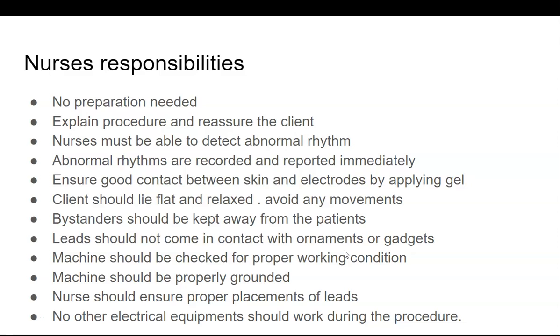Nurse's responsibilities. What is your role when you do an ECG? No preparation is needed for the patient, but you should explain the procedure, reassure the patient, provide a comfortable position and provide privacy. Nurses must be able to detect abnormal rhythm. When you do an ECG, you are responsible for noticing changes in it. If not, you should show it to the senior nurses or to the doctors. Abnormal rhythms are recorded and reported immediately. If you are in a cardiac ward and monitoring the rhythms, you have to note the abnormal rhythms, record them and report them immediately.